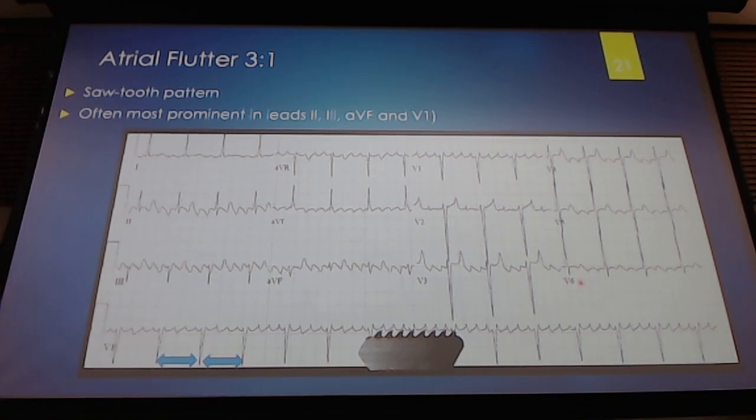It's the atrial rate that makes this the tachycardia. When you feel the person's pulse, can you feel the atria contracting? No, it's the ventricles contracting. So you're like, well, we've got a rate of 60, 70. Why is this person weak and dizzy then? Why are they lightheaded? I better get that EKG. You get that EKG, and you're like, oh, this is the reason why. The ventricular rate's okay, but the atria is doing this, and that's the problem.